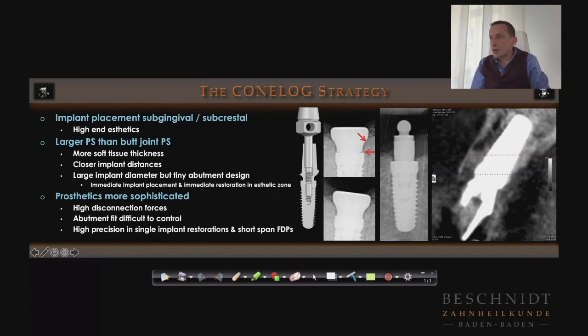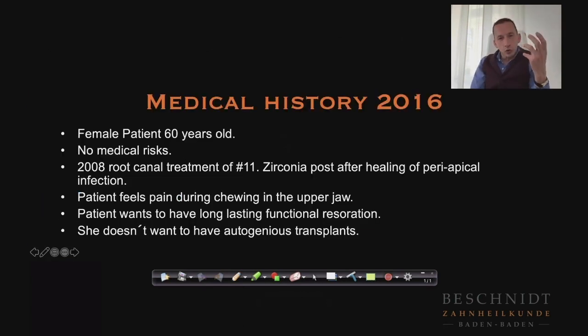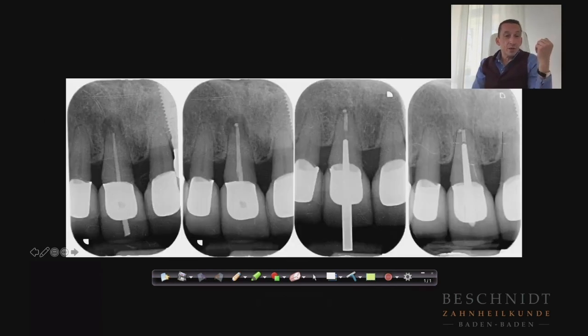Let's have a look at one of the final cases, how I use the Conelog, especially in the aesthetic zone. 2016, this lady presented with some root canal treated teeth. Of course, she already had some bony resorption, but she wanted to keep the teeth.